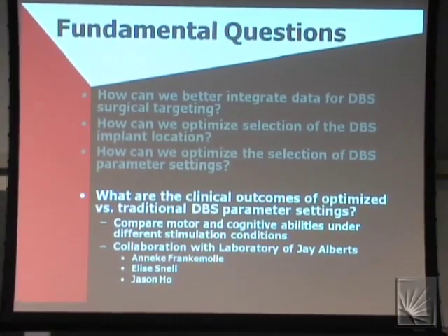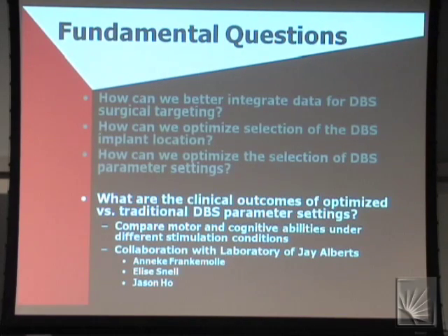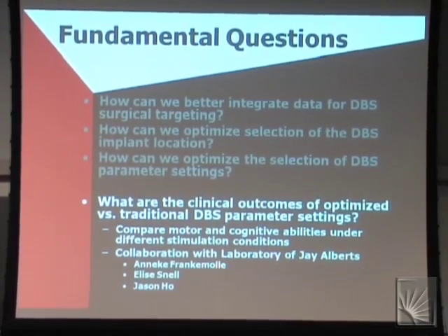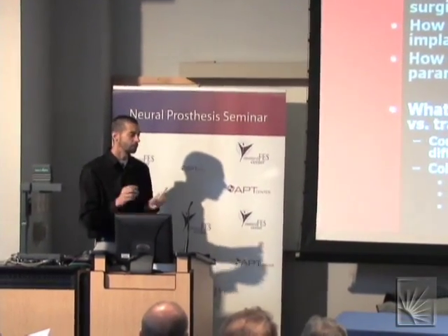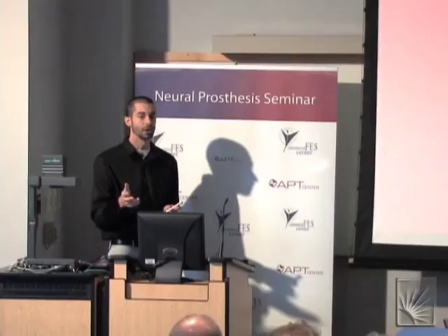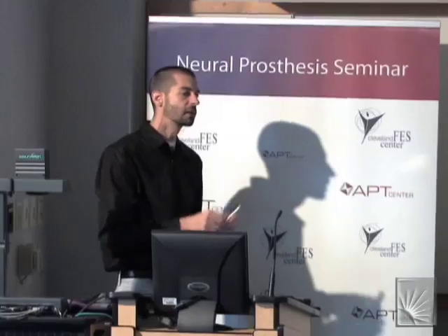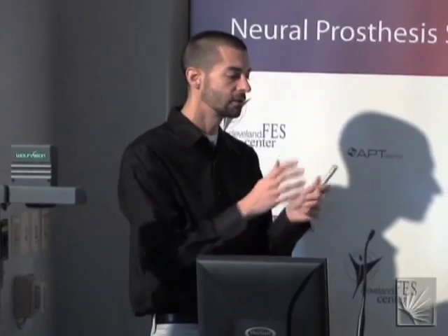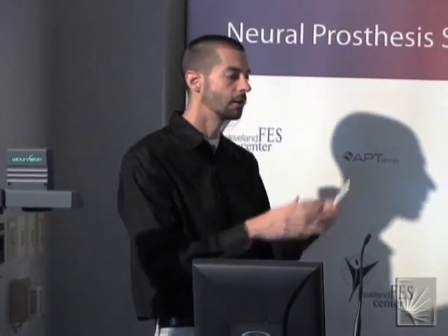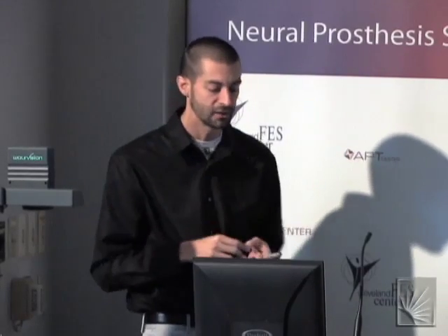And so this study was set up and run by Jay. And the people in my laboratory were completely blinded to anything about these patients. All we received was their imaging data and their intraoperative microelectrode recording data. And then we subsequently selected a stimulation parameter setting that Jay would clinically test in these patients. And then the clinical testing was set up such that the patients were randomized one day or the other to evaluate their clinical settings or their model predicted settings, doing some tasks I'll tell you about in a minute.